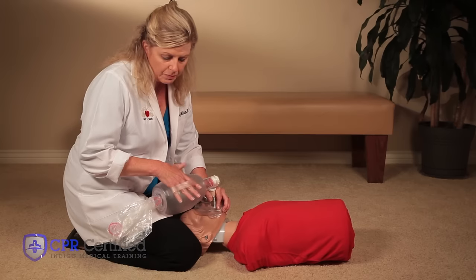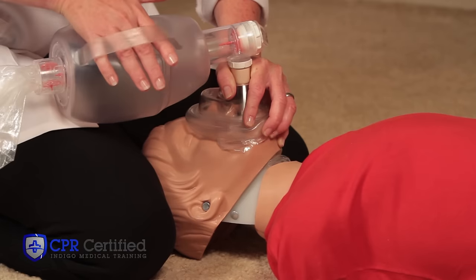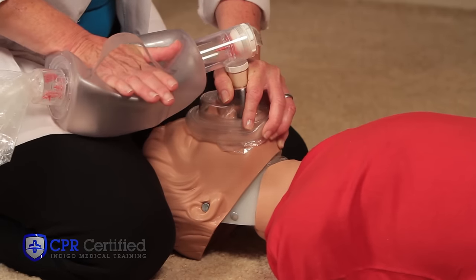To perform breaths, simply push down on the bag part, giving two breaths, about one second each. Allow for chest rise. Two breaths should take no more than five seconds.